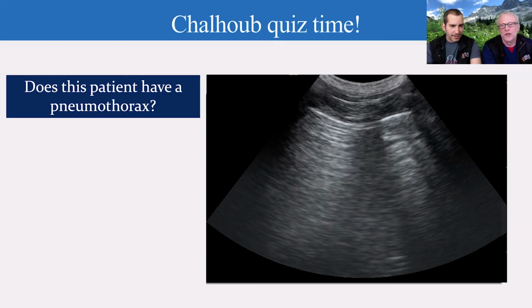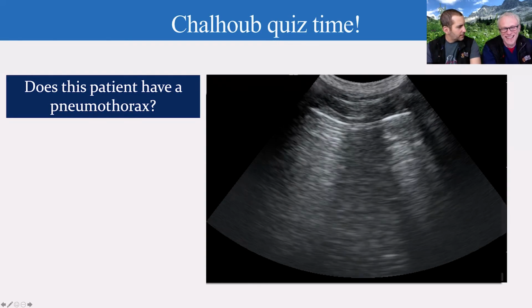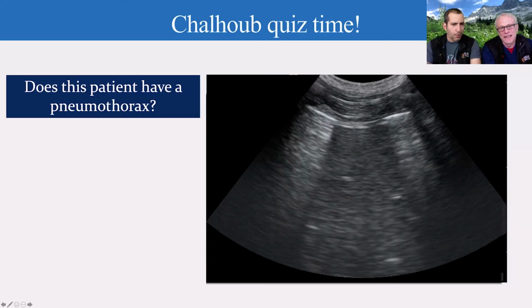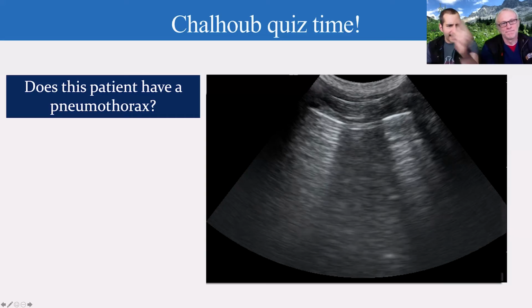Is this normal or abnormal, Dr. Chalhoub? You never told me it was going to be a quiz, Dr. Boysen. Okay, I see two there, Dr. Boysen, and it looks like it disappears. This does not look like a normal curtain sign to me, Dr. Boysen. So I'm going to say yes to pneumothorax.